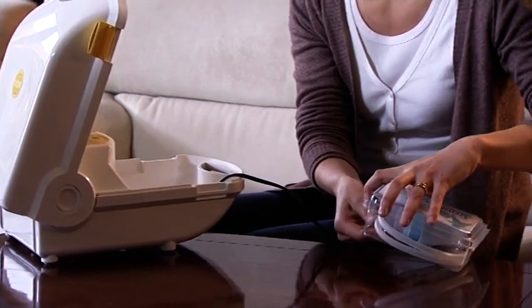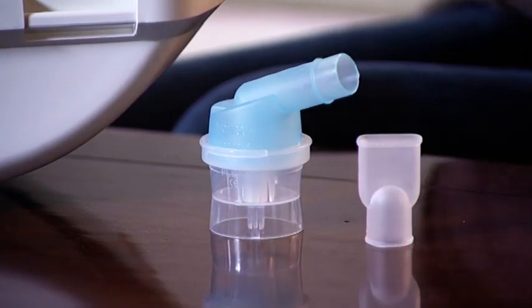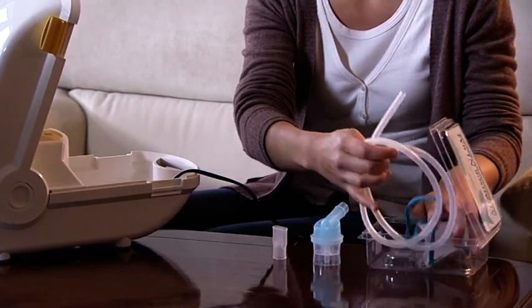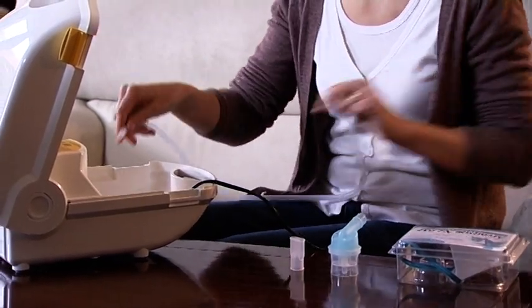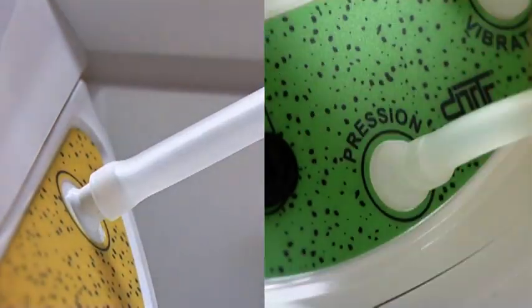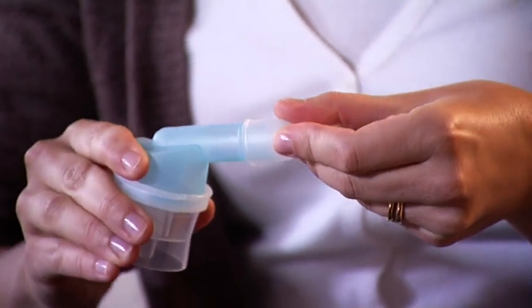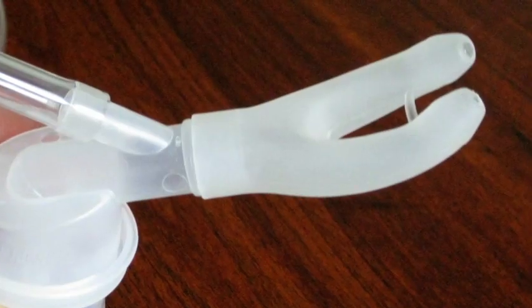Take out the parts of the nebulizing kit containing a mounted nebulizer, a mouthpiece for the standard model, or nosepiece for the sonic device, both to be used instead of the mask. One tube for the standard model, and two for the sonic one. Connect the tube that reads pression to the matching piece on the device. According to the model of the compressor, fit either the mouthpiece or the nasal one onto the nebulizer.